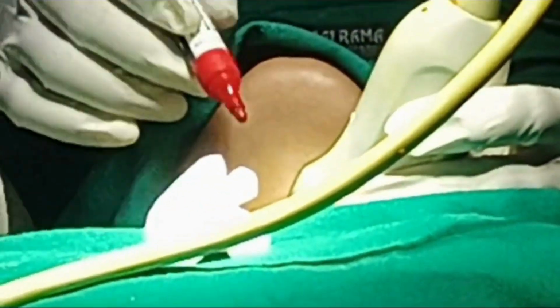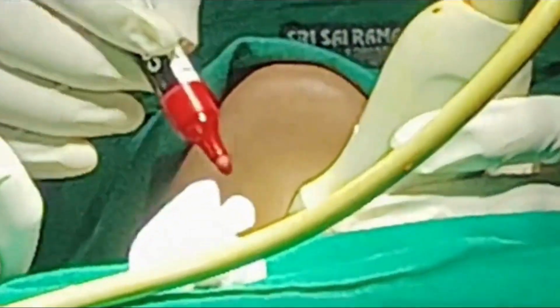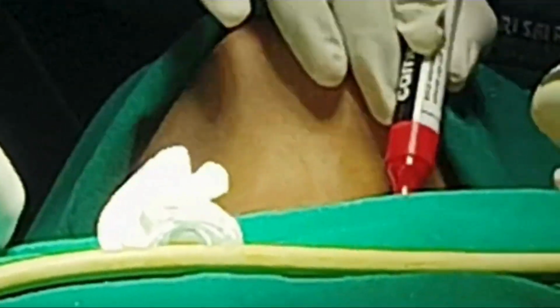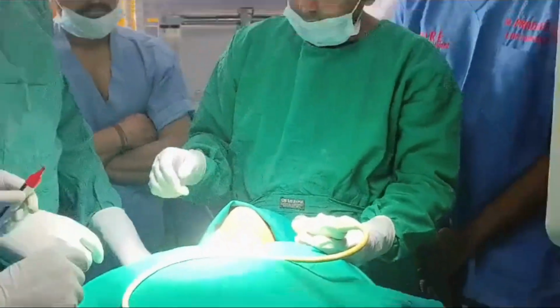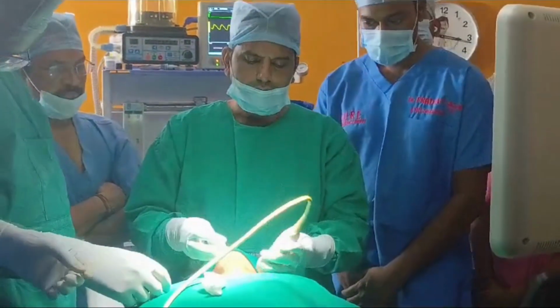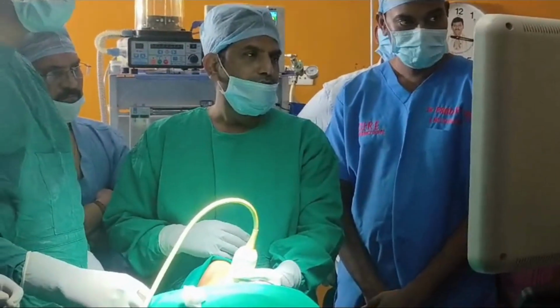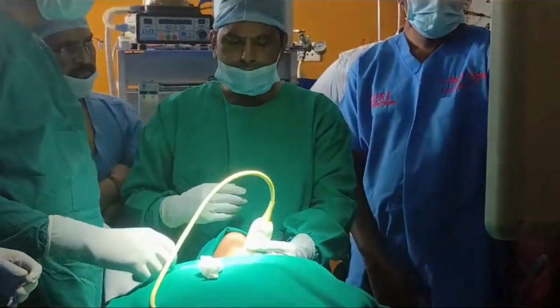You put in the center and this center. Okay, this center is center, this center, right? And you join this. Blue is better. Now see the dimpling here. Where is the strap muscle? Pritam, you show me.